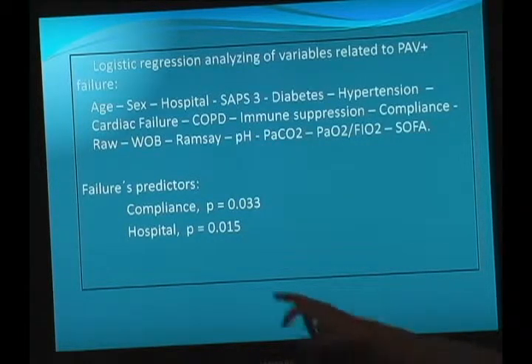And also an important point, hospital. As you can see, our rate of failure ranged from hospitals with 15% to 55%. So probably my advice, if you want to start a new trial on that, select your colleagues carefully, because from the very beginning everyone is more optimistic about the ability to work with that, but in the long term there is plenty of trouble appearing.